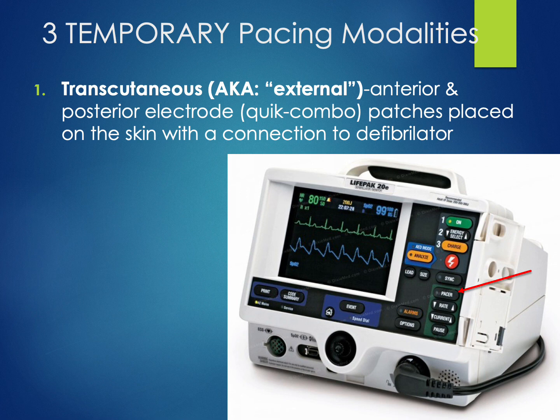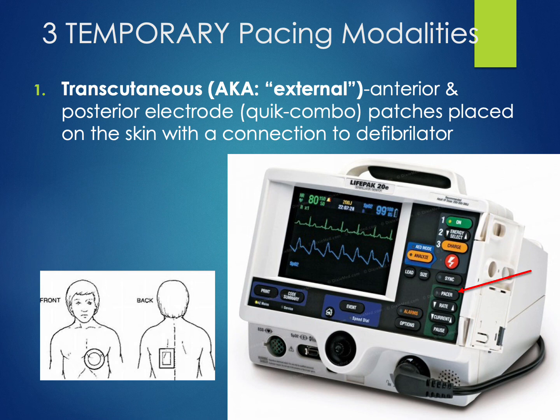With a transcutaneous pacer, we are pacing the patient's heart with the same exact pads that we would use to defibrillate them, to shock them. And we're using the same exact machine, the defibrillator. Now the pads are placed so one is on the chest and one is on the back. But think about how uncomfortable this must be, getting shocked at a set rate constantly through these pads on your chest and on your back. This is not an ideal situation.